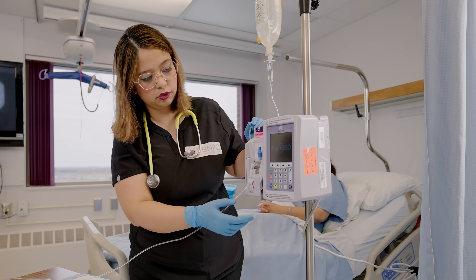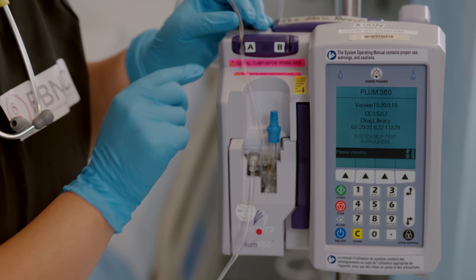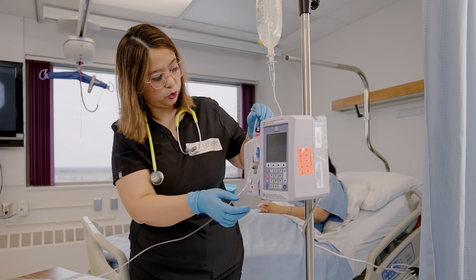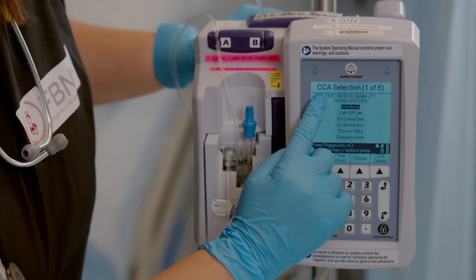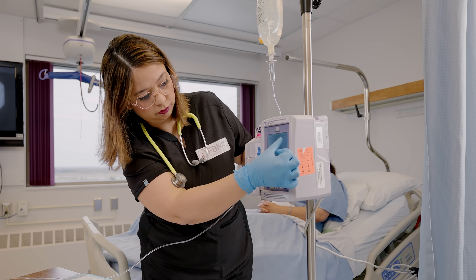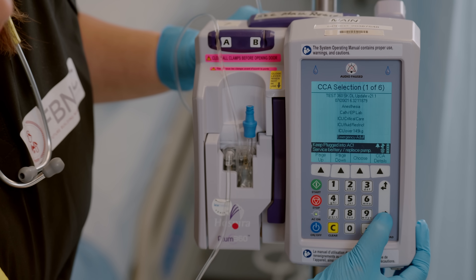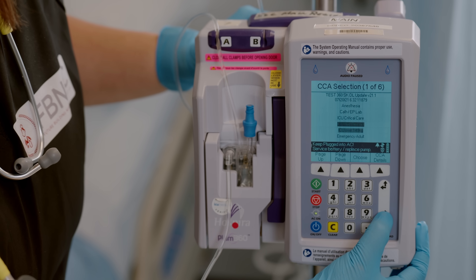Turn the device on with the blue button — it will run through some diagnostics first, which is normal. After the diagnostic, the pump will ask: is this a new patient? Select yes, and you will see the CCAs — Clinical Care Areas. You can scroll and choose the area where you are working, such as ICU, medicine, or surgery. Afterwards you can access the drug library.